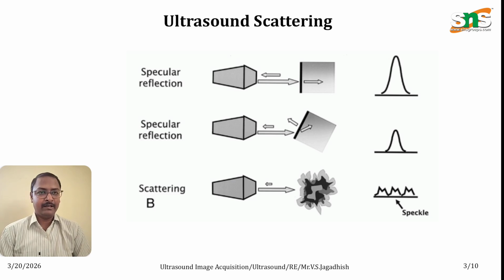The larger arrow indicates the direction of the produced ultrasound. The smaller arrow next to the dark line is called transmission, and the smaller arrow near the transducer side is called the echo. From that echo, we get the image in the ultrasound equipment. If the surface is smooth and perpendicular to the direction of the sound waves, we can acquire an image of good amplitude.